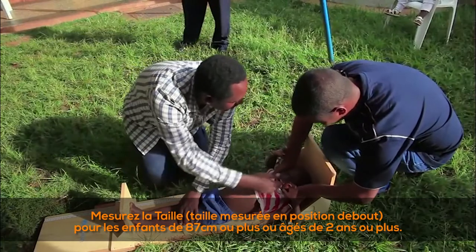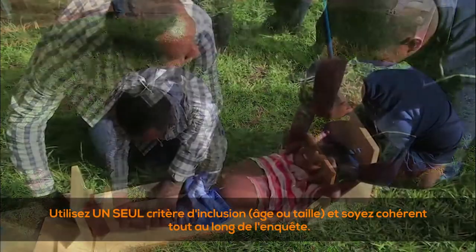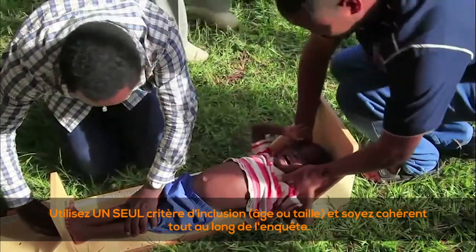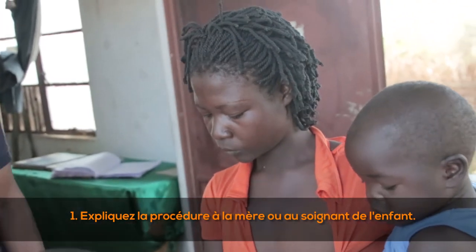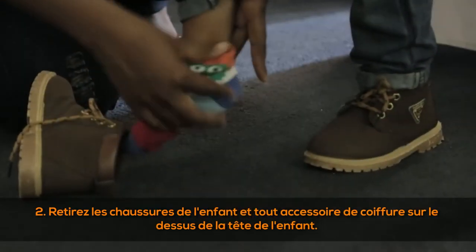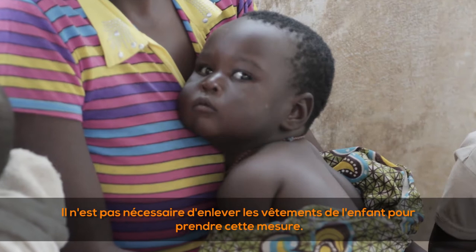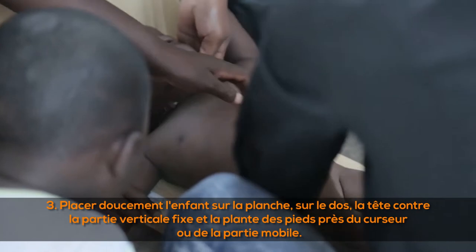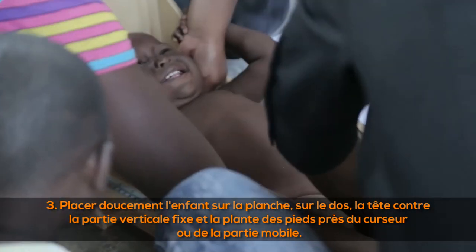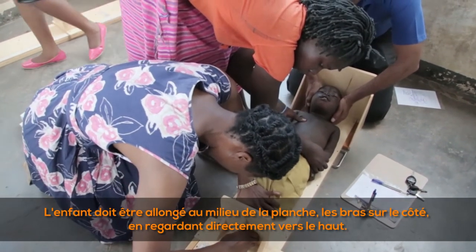Measure length when the child is less than two years of age or less than 87 centimeters. Use one inclusion criteria — age or height — and be consistent throughout the survey. (1) Explain the procedure to the child's mother or caregiver. (2) Remove the child's shoes and any hair ornaments on top of the head; clothing does not need to be removed. (3) Place the child gently onto the board on his or her back, with the head against the fixed vertical part and the soles of the feet near the movable part.